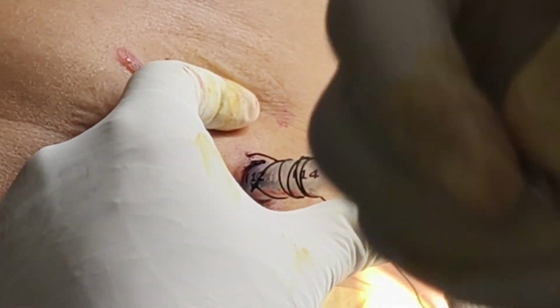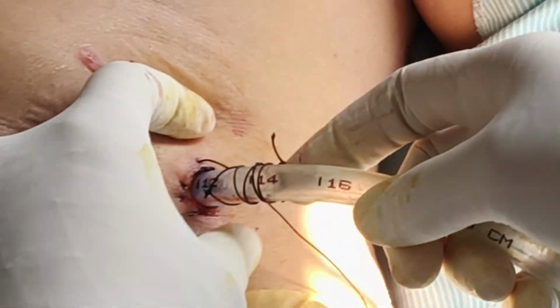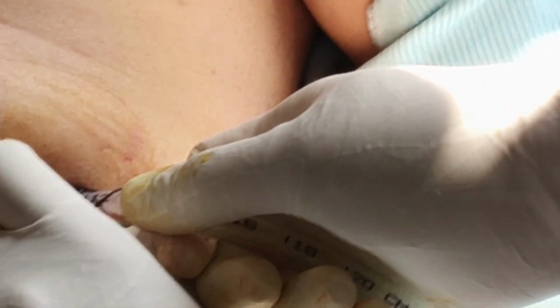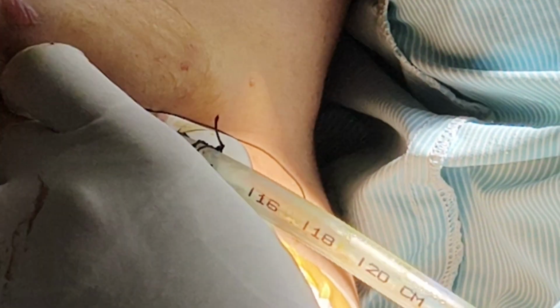Now the drain has been disconnected. Bring this in. Okay, now I have pinched it. I'm pinching it because when I remove the drain I will have to manually pinch the wound so that there is no hole, so that I have time to do what?